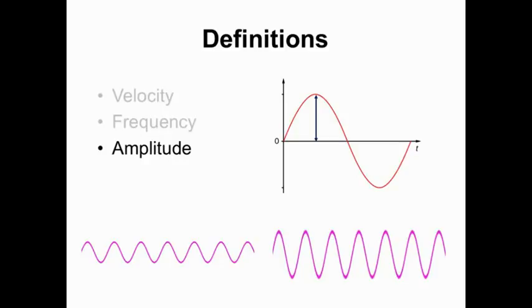Similar to how the timing of returning waves is used to plot depth on the screen, the amplitude of returning waves determines how bright these points will be. Areas of strong or high amplitude reflected waves are plotted as brighter points on the screen. Areas of weak or low amplitude waves will be visible as darker points on the screen.